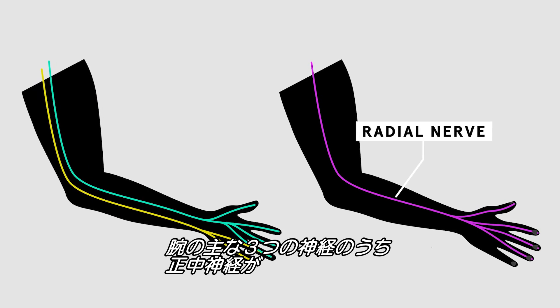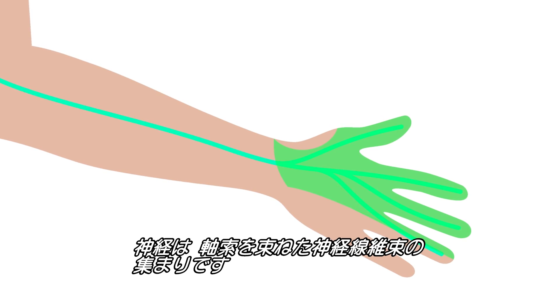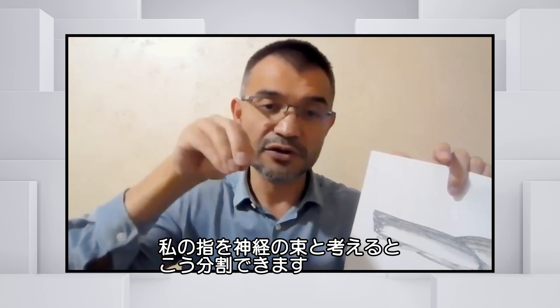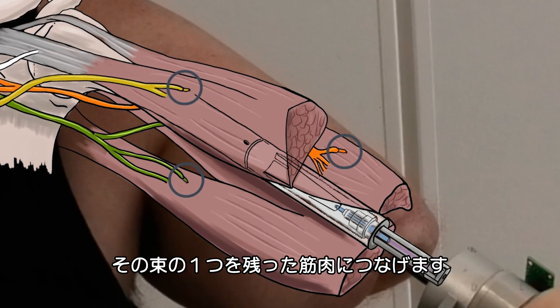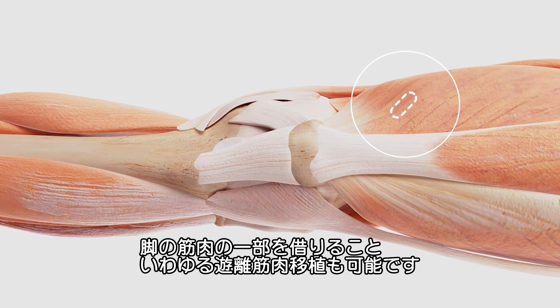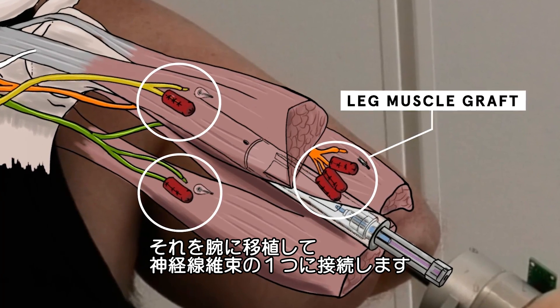There are three big nerves in the arm — the radial, the ulnar, and the median — which control these three fingers. A nerve is a collection of axons bundled into fascicles. You can split those fascicles: take one bundle to connect with an available muscle. For the others, a piece of muscle can be borrowed from the legs — called a free muscle graft — and transferred to the arm to connect to one of these fascicles.